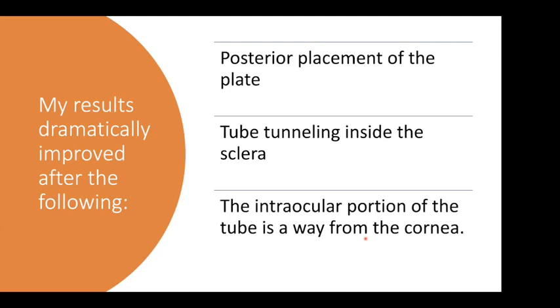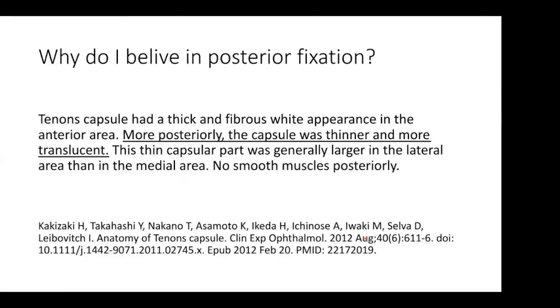And they moved from the area of being like, I have a lot of questions around the valves, to a procedure which I really love and I advise, especially when there is a good indication for the valve. Now, why do I believe that posterior fixation is good? Because I found this article, actually, nowadays, on why the results are better, why I found better IOP control in my hands: more posterior Tenon's capsule, very interesting, thinner and more translucent.